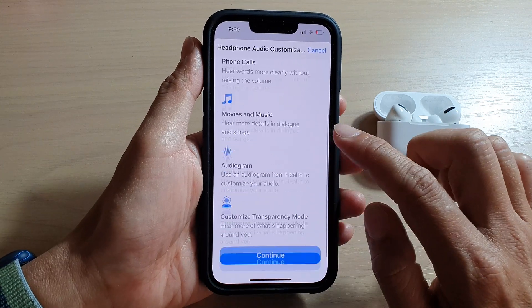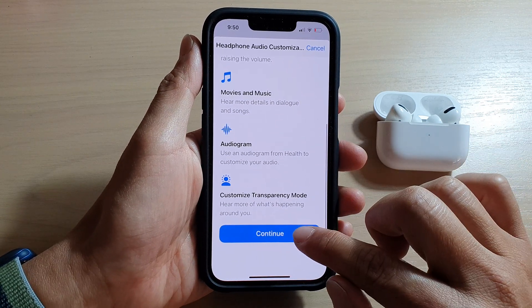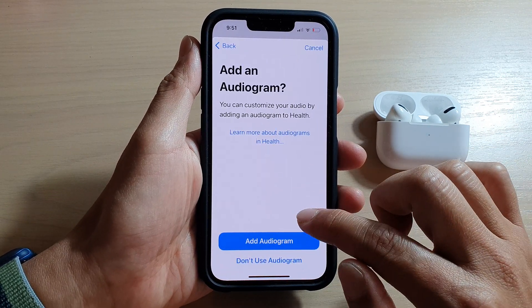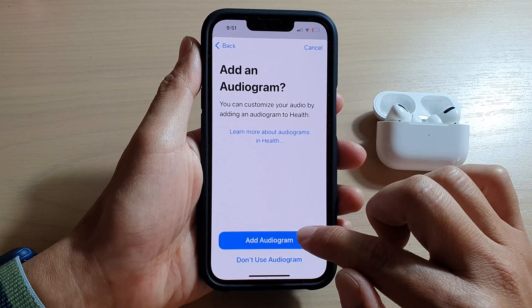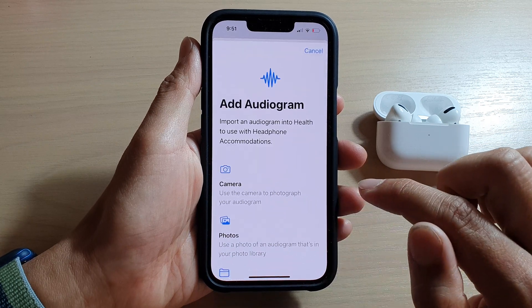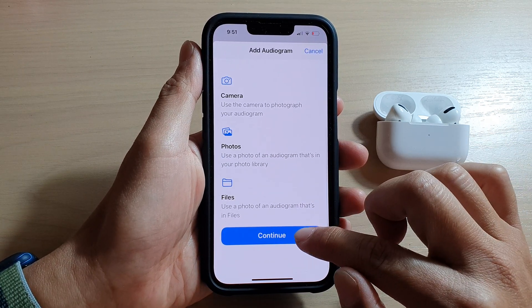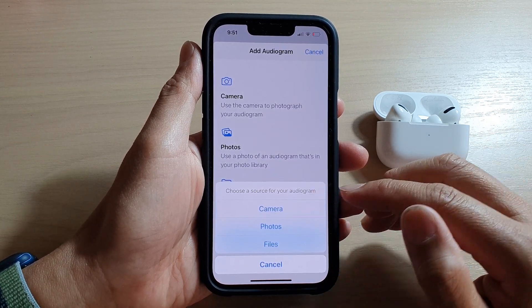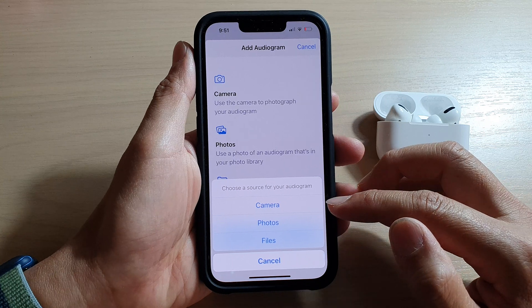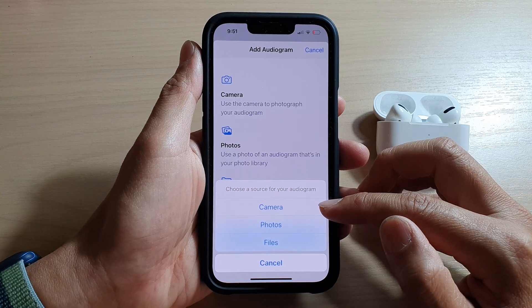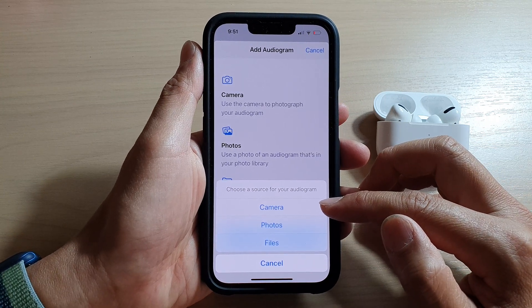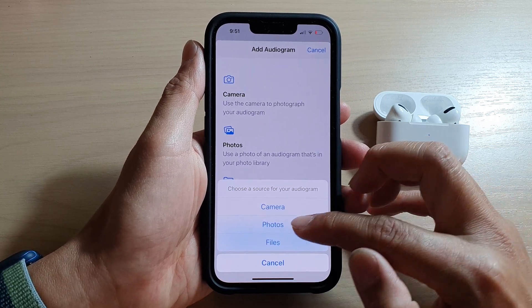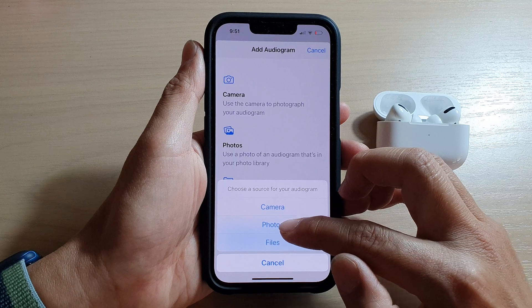After that, go down and tap on Continue, then tap on Add Audiogram. Next, go down and tap on Continue again. In here you can choose a camera to scan for your audiogram data, or you can choose from photos.